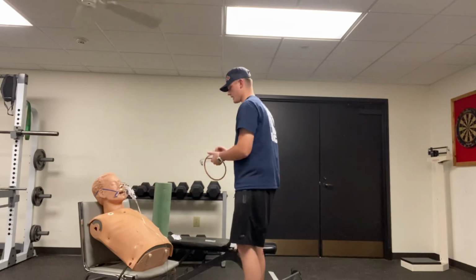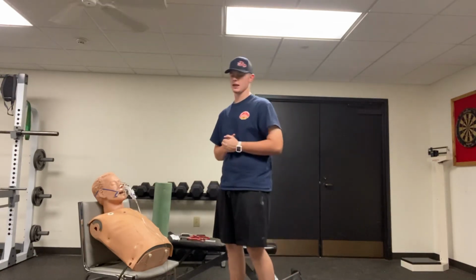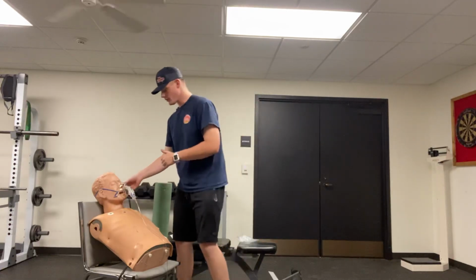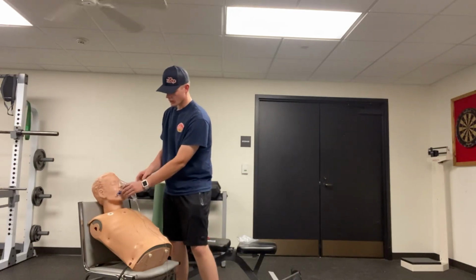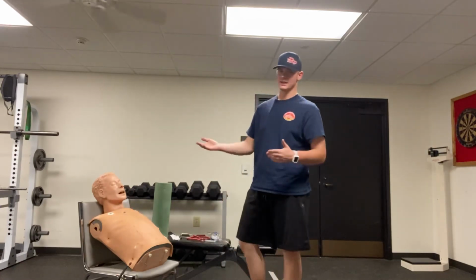Alrighty, so I will take note of any positive or negative effects of this medication. I will then remove the mask once the nebulized treatment has been given. Alrighty, I'm going to remove it, continuing to assess his work of breathing.